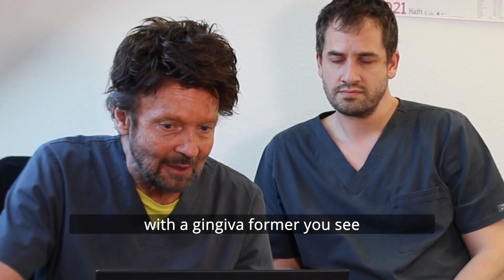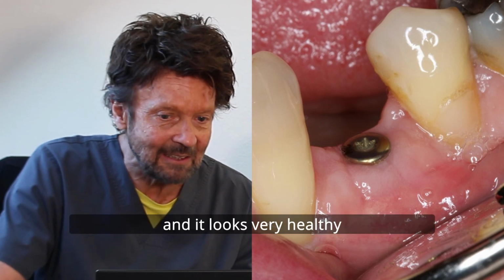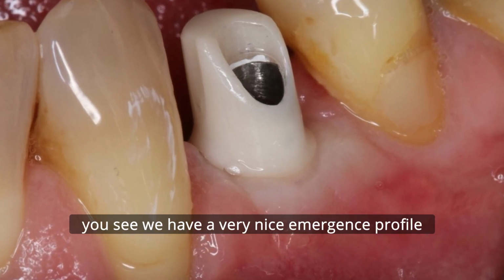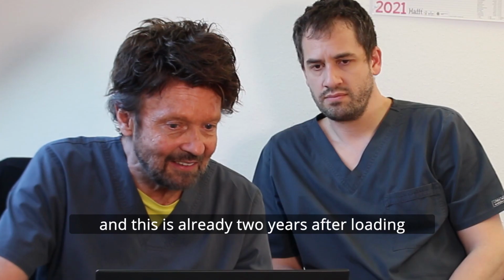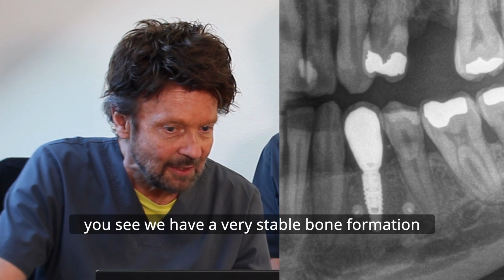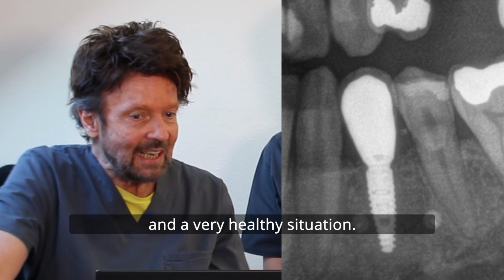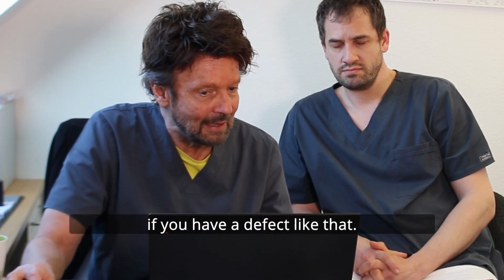With the gingiva former, you see we have a nice keratinized gingiva, and it looks very healthy around our implant. And this is a ceramic abutment. You see we have a very nice emergence profile, and this is a ceramic crown in position. And this is already 2 years after loading. You see we have a very stable bone formation and a very healthy situation. This is a typical indication for the bone ring technique if you have a defect like that.